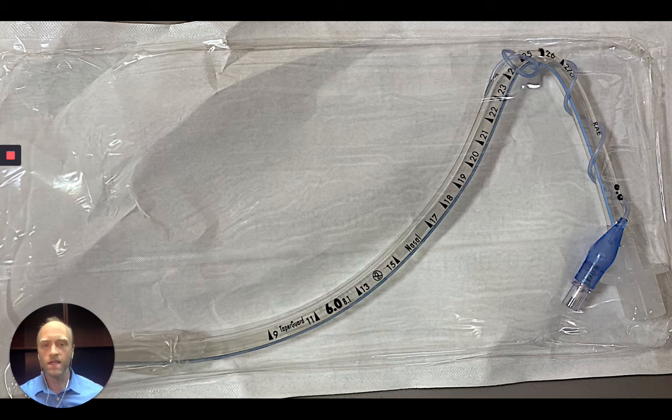One safety consideration that I like to keep in mind is that small caliber endotracheal tubes are also shorter. So a 6.0 tube is shorter than an 8.0 tube. The standard 6.0 tube that we stock is 28 centimeters in length, and that should be long enough for the nasal approach in most people. However, if you have a particularly tall patient, it may not be.